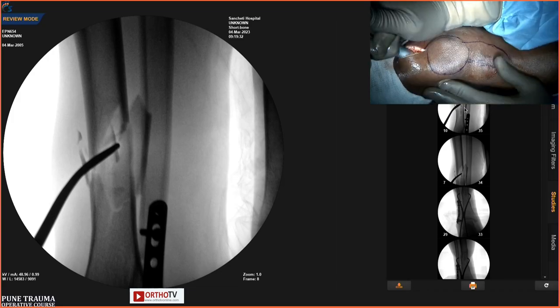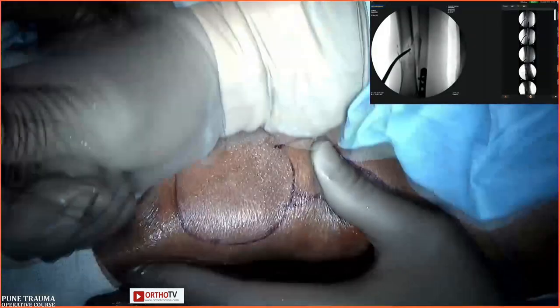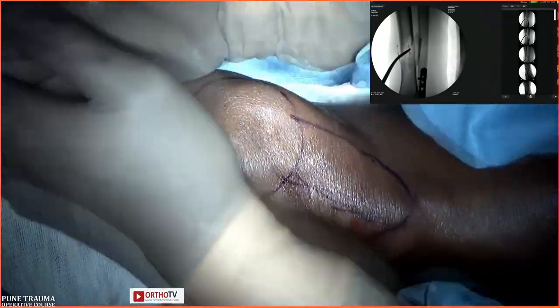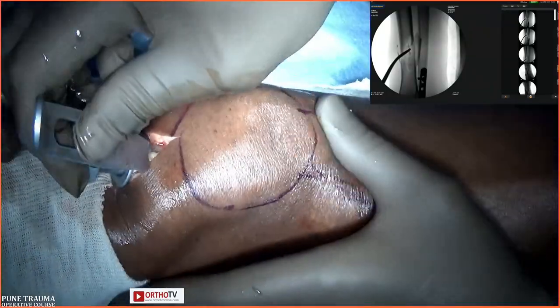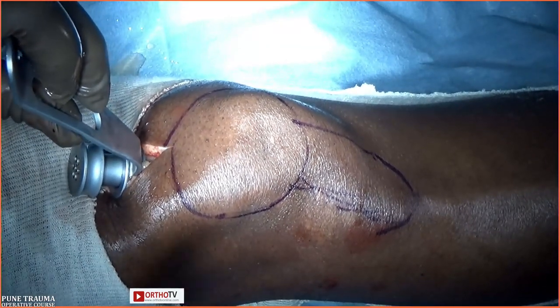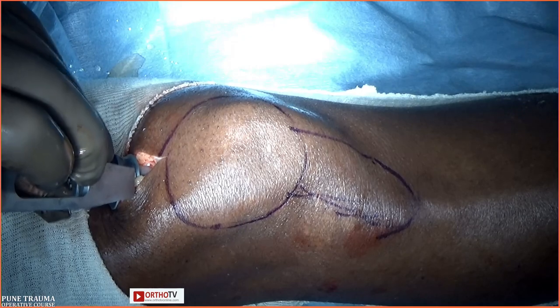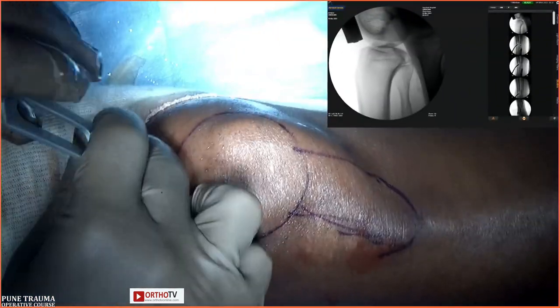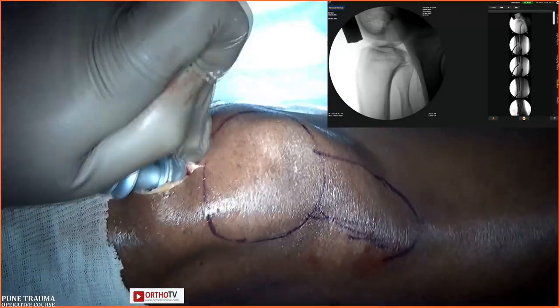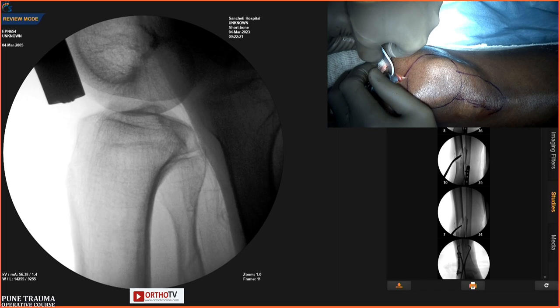Can you zoom in on the surgical screen, please? Now you can see the lateral X-ray. Now we have reached the upper part of the tibia. So the assistant will hold this thing. Hold it like this, press it down, sir.